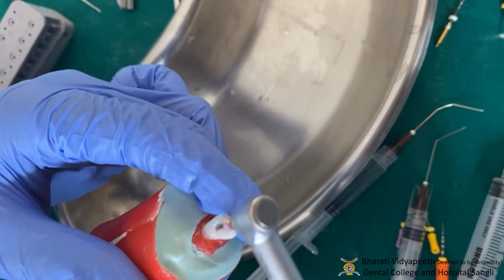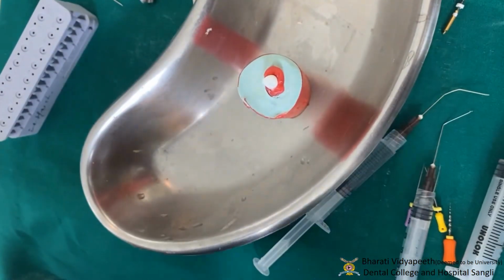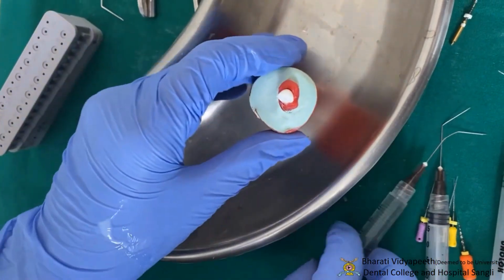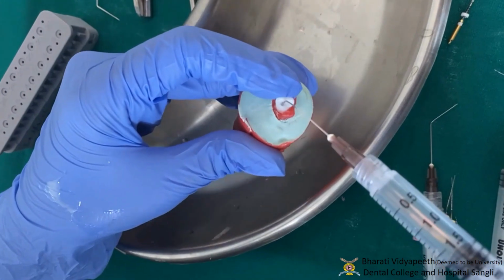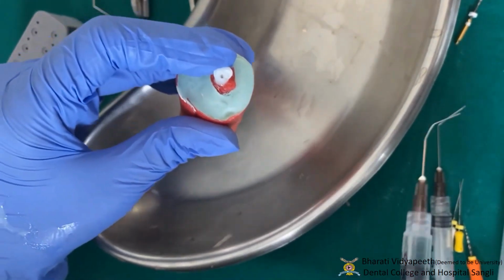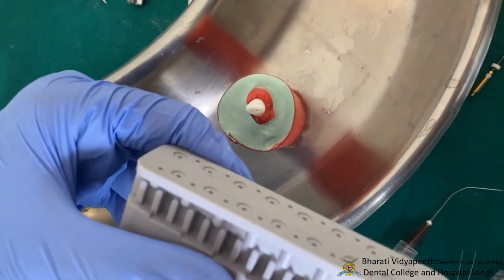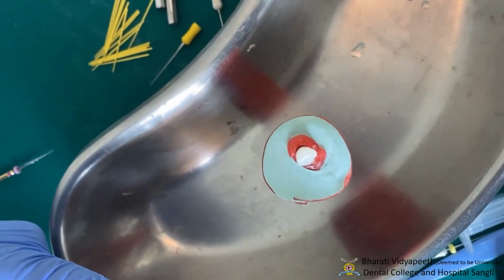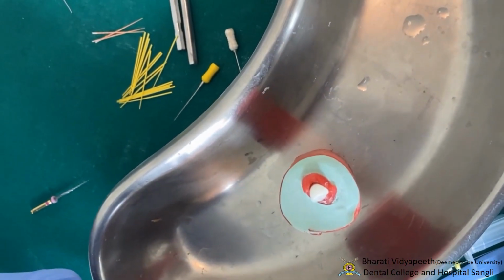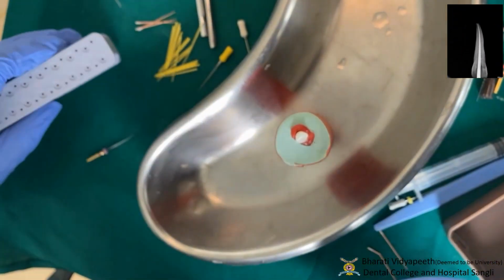After preparation with S1, the preparation is extended to S2, F1, F2 and F3 files. Between each instrument, irrigation with sodium hypochlorite and normal saline is done. After each instrument, recapitulation is done with a number 10 K file. When the biomechanical preparation is completed, the master gutta percha is inserted into the canal according to the working length.